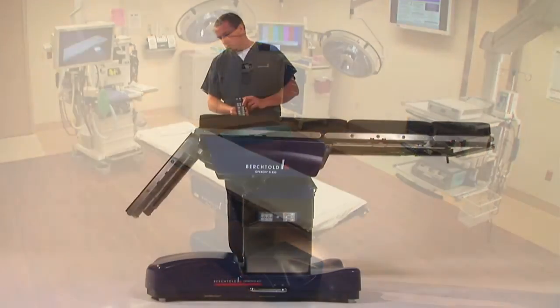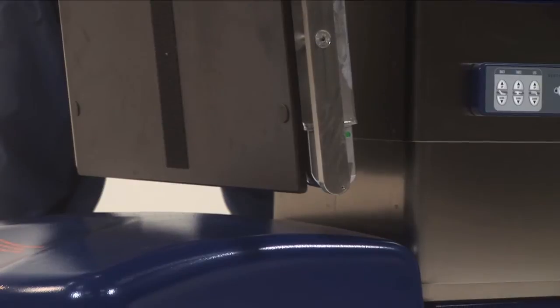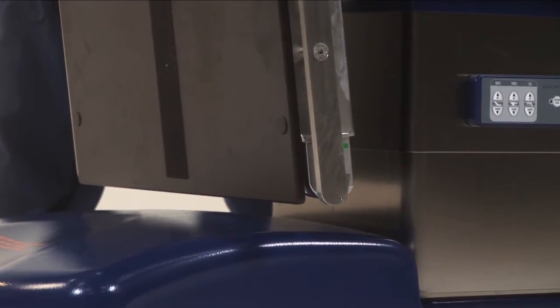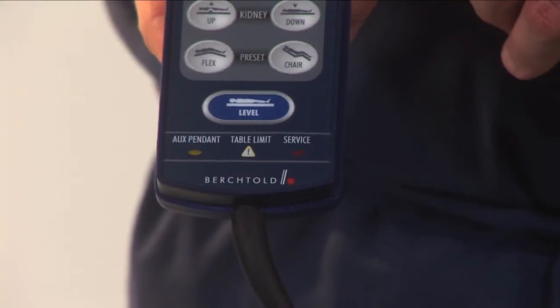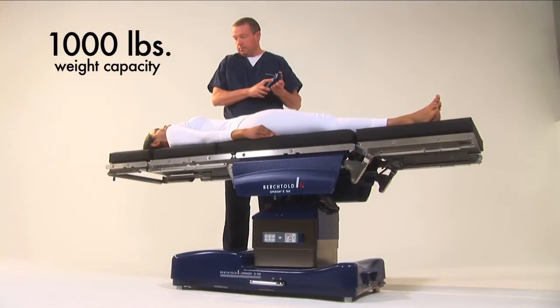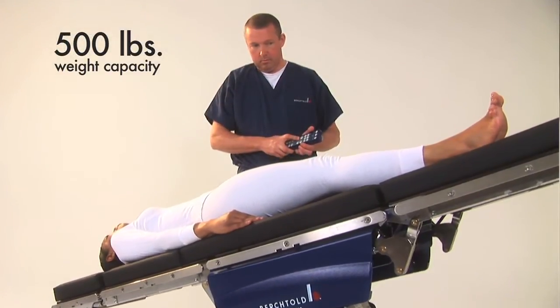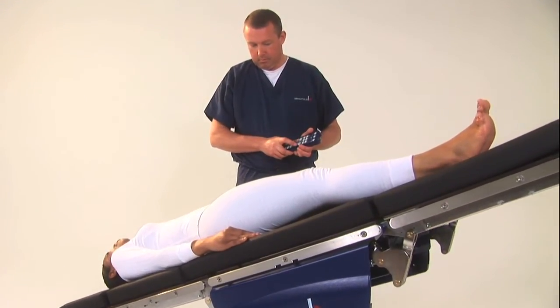The table's internal diagnostic system recognizes when a section is removed and instantly recalculates the crash prevention parameters, ensuring patient and staff safety. The patient weight capacity is 1,000 pounds in normal orientation and 500 pounds in reverse orientation to meet today's unique bariatric challenges.